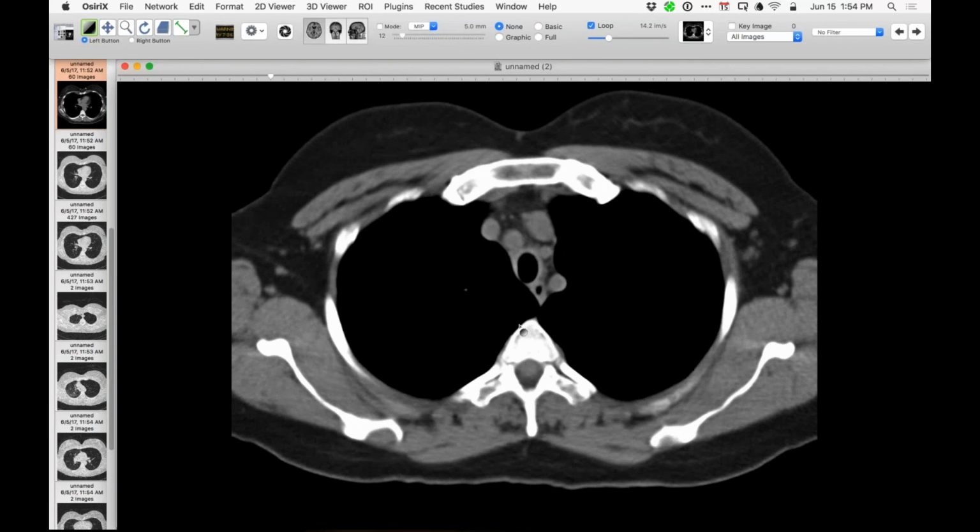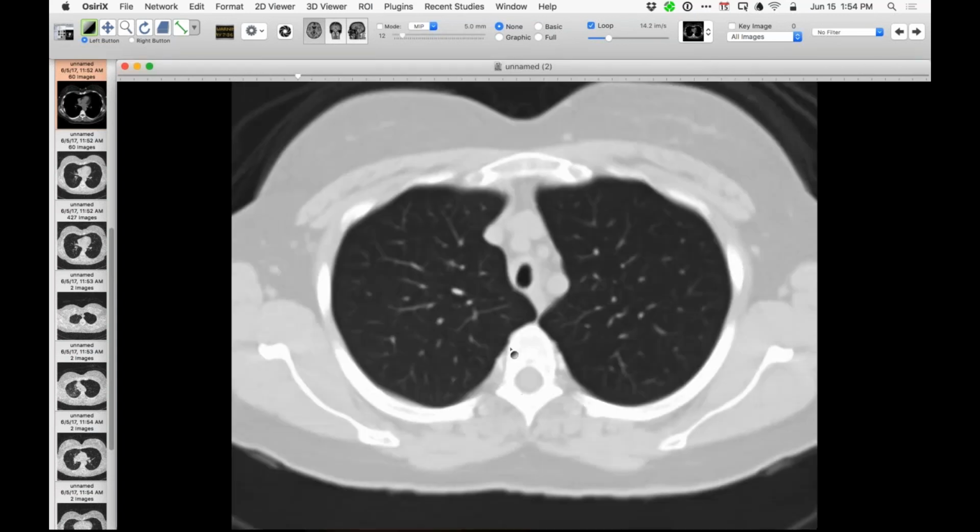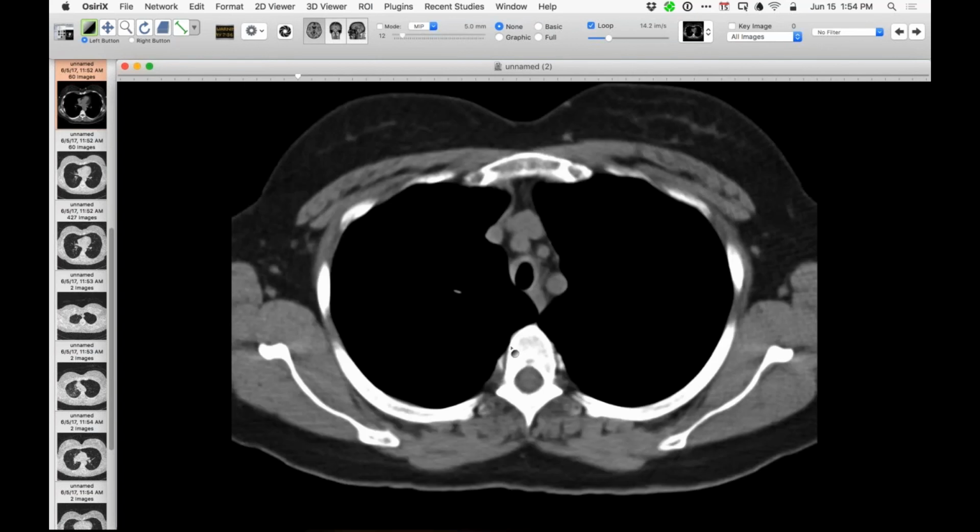Yeah, Howard, I can't think of anything else that would look like that. Very suggestive, isn't it? Yeah. Excellent. So that's the way that we reported that out, that Leif and I looked at it too.